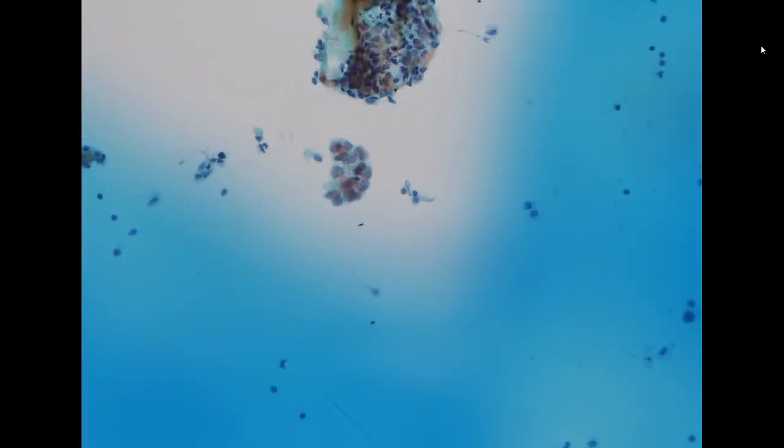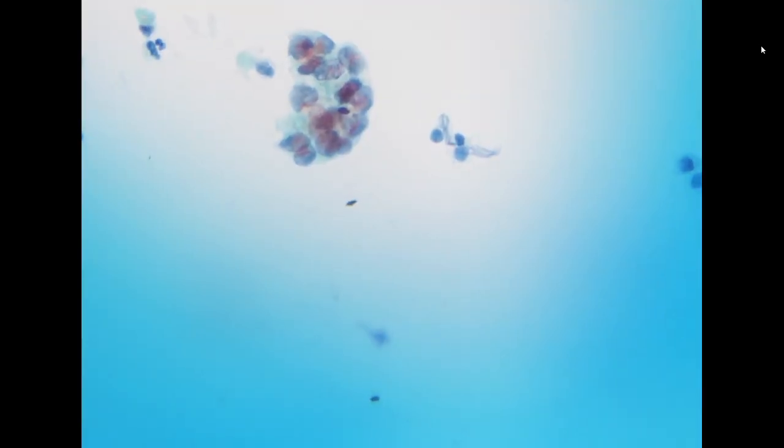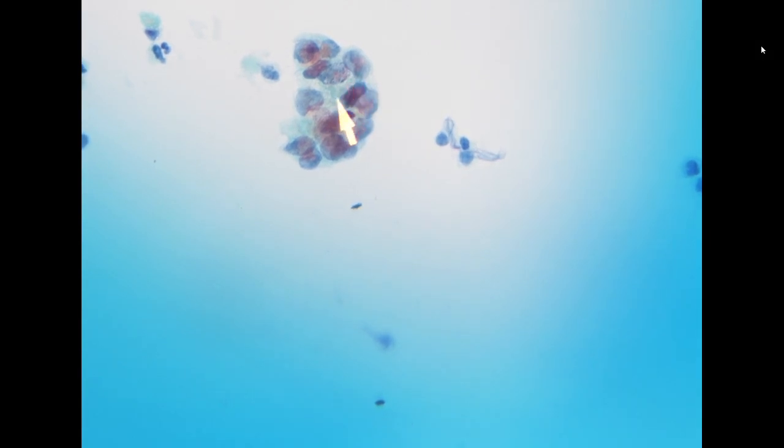cytology examination. So in this cytospin preparation, we can see cluster of atypical cells with three-dimensional architecture and glandular arrangement. In this area, it shows drying artifact, so chromatin pattern is not very clear. But you can see here, it looks more like an adenocarcinoma.